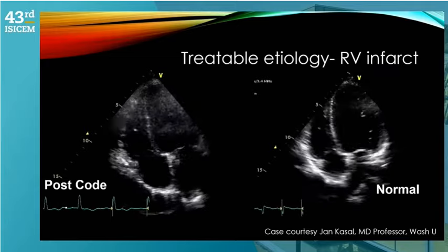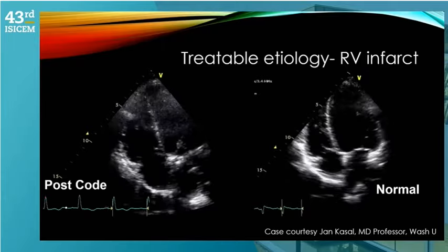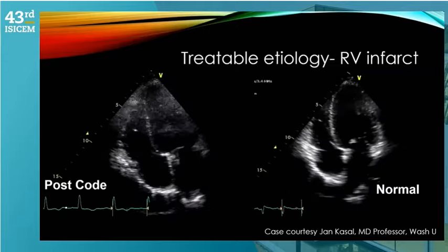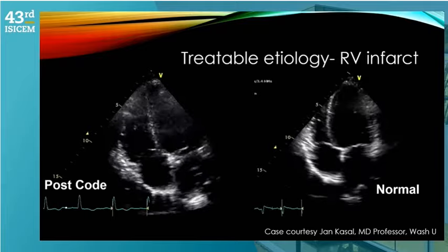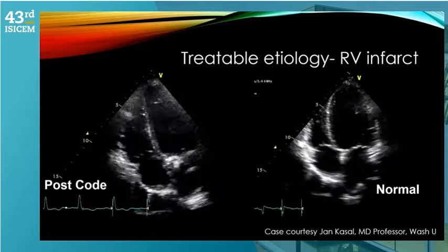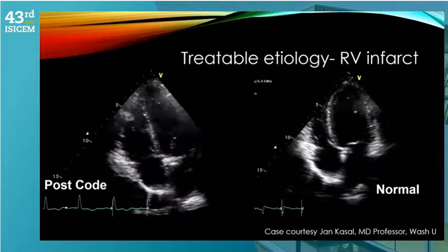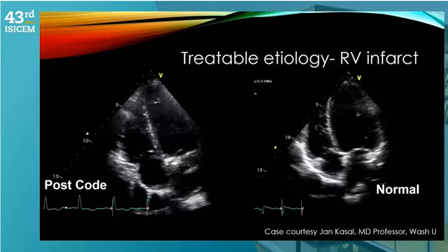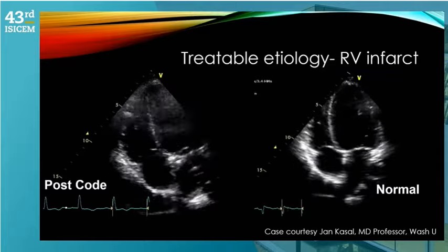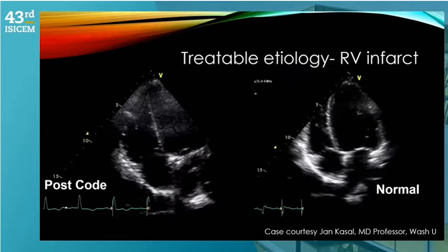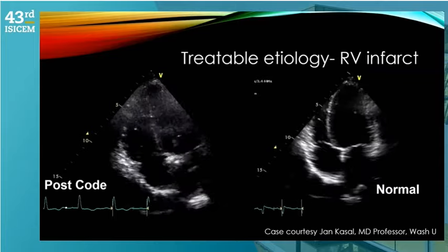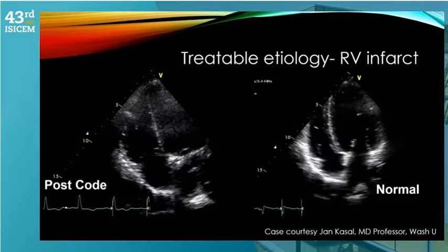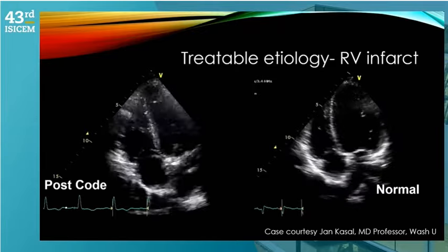Another treatable cause is acute MI. This was a post-cardiac bypass surgery patient who had an uneventful perioperative course, was extubated, then suffered a cardiac arrest on day two. On the right you can see a normal apical four-chamber with very nice RV movement, while on the left the RV is barely contracting, although the LV is fine. The cause of shock was complete RV failure. The diagnosis of acute right RCA infarct was made by EKG as well. Rather than waiting for troponins, knowing the patient's pre-op normal echo and the regional wall motion abnormalities associated with RV infarct, the patient went to the cath lab where an RCA dissection was found.